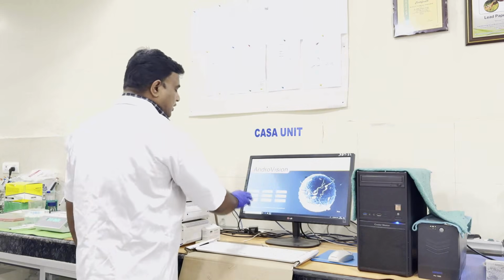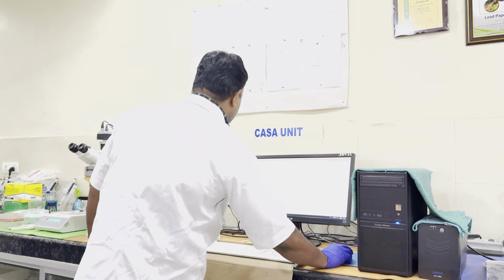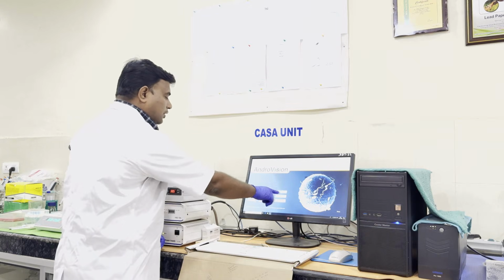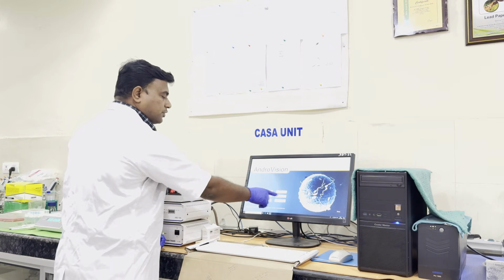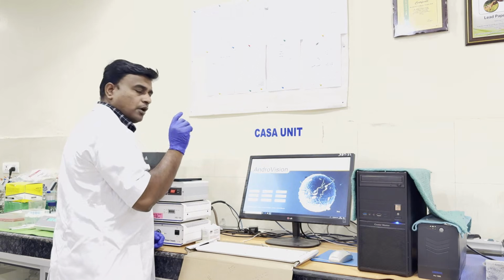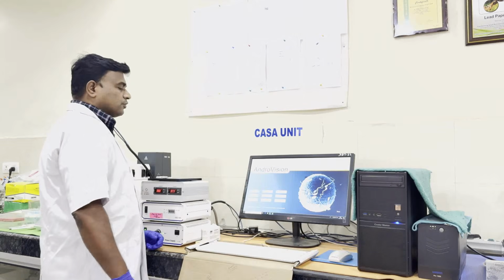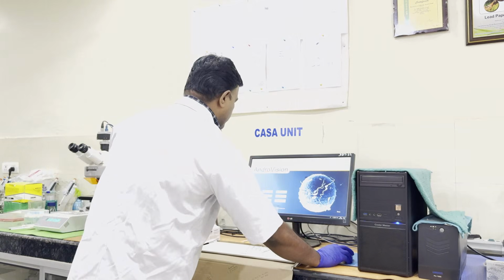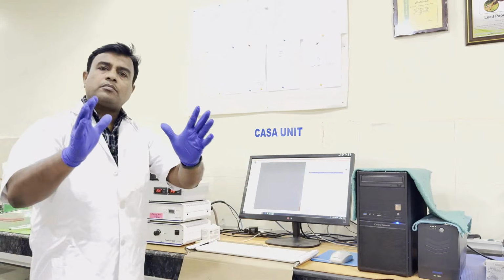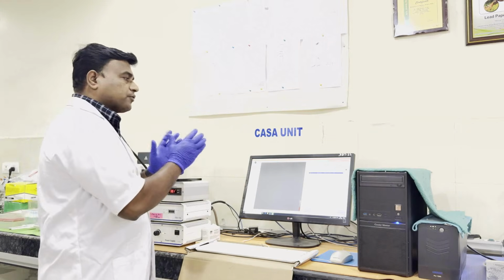In this interface you get various types of parameters, and you will see tabs such as motility, advanced analysis, quality control, reports, review, morphology, morphometry, database, setup, and support. But we are very much concerned about the motility and concentration. So just open the interface, and once it is open, it will come up like this. It will vary from CASA to CASA, no doubt. This depends on the type of software used.